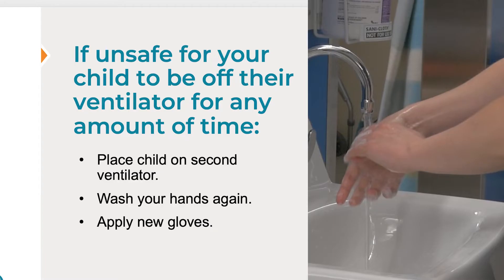If your doctor says it's safe, you can take your child off the ventilator during the circuit change process. But if it is not safe for your child to be off their ventilator for any amount of time, you must place your child on their second ventilator prior to beginning a new circuit change. When your child is comfortable breathing on their own or with their spare ventilator, wash your hands again and apply new gloves.